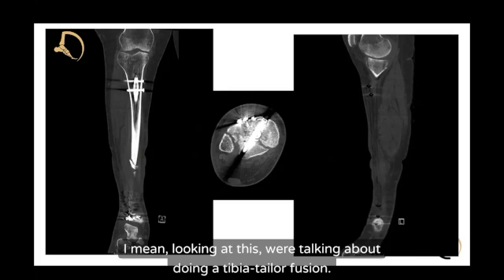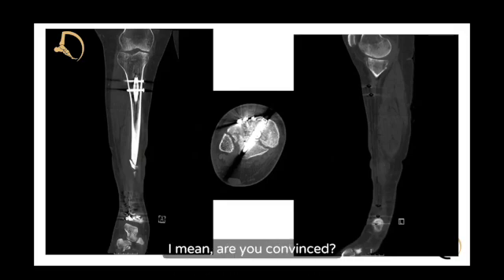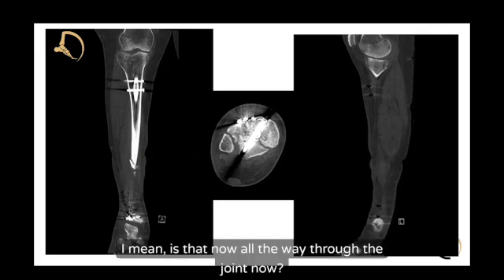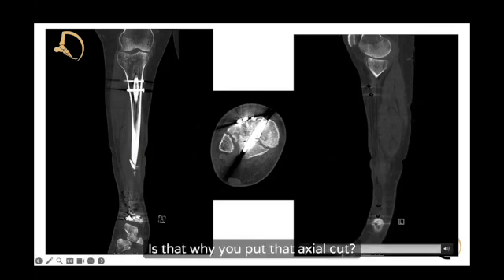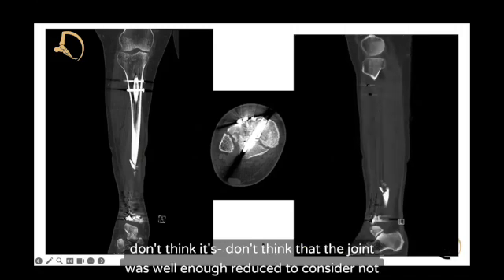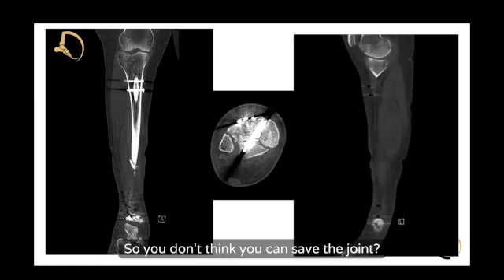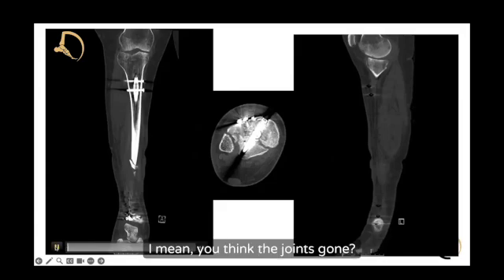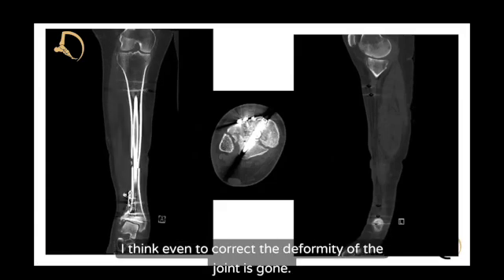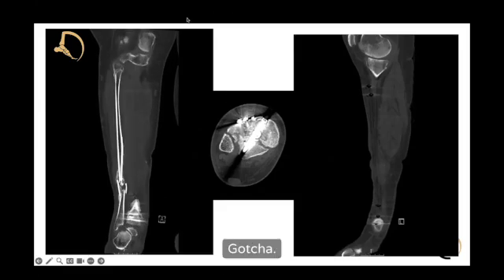We were discussing doing a tibiotalar fusion. How would you approach a tibiotalar fusion in this case? The joint was not well enough reduced to consider saving it — I think the joint's gone. Even to correct the deformity, the joint is gone. I don't think you can get fixation distal enough to save it. If the joint were salvageable, you could fix this with a frame, but if it's not, fusion is the option.